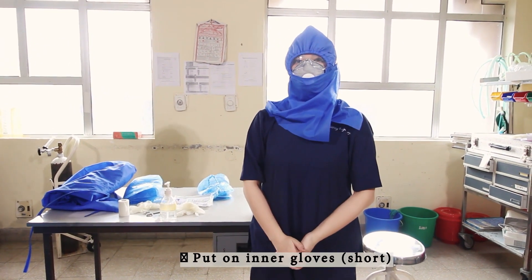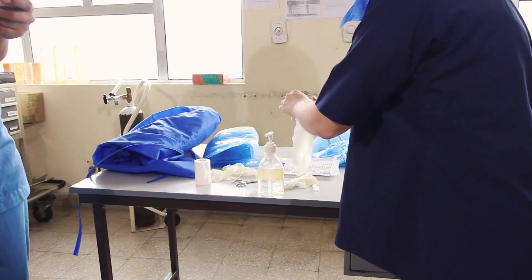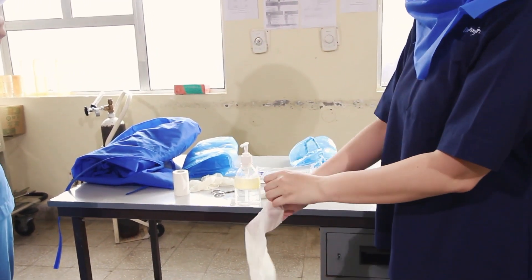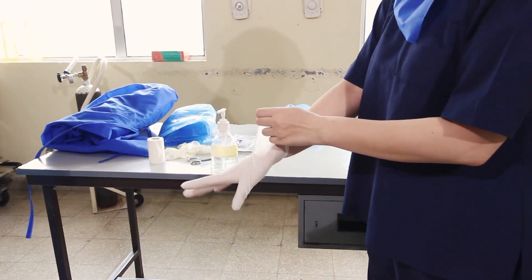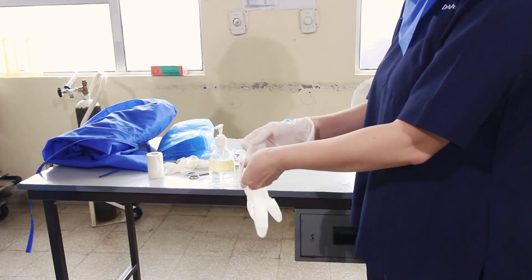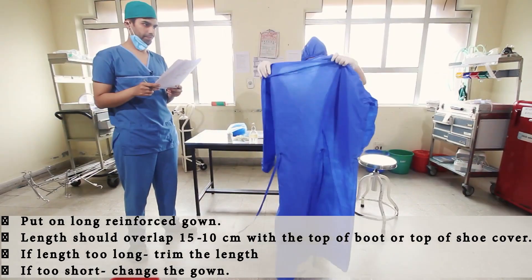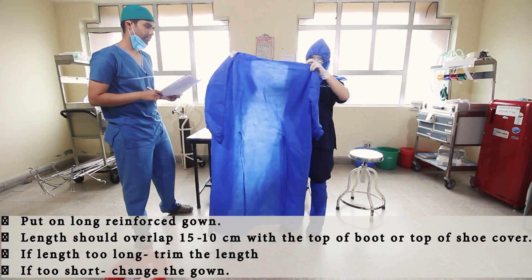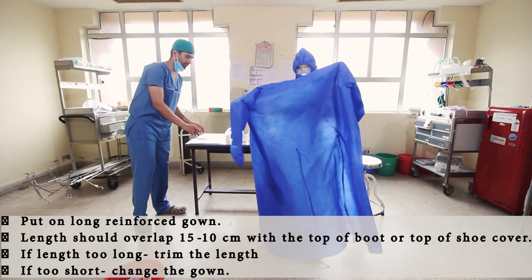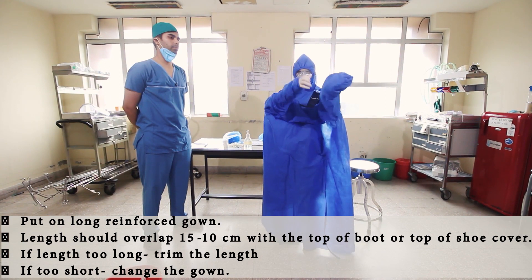Now we'll put on the inner gloves — the short ones. After the gloves, we'll put on the reinforced gown. It should be of adequate length, neither too long nor too short.